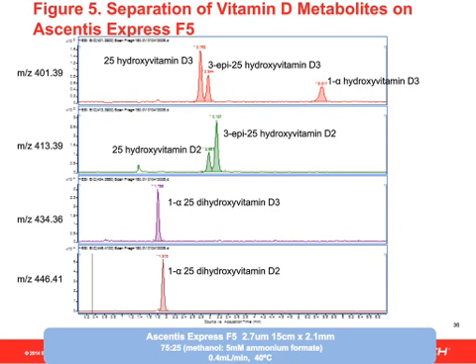So we felt pretty confident that now that we've developed optimized chromatographic separations, we optimized the mass spec conditions to be able to get the best response out of ESI ionization. So the next part was to move forward and look at the sample processing portion of that.